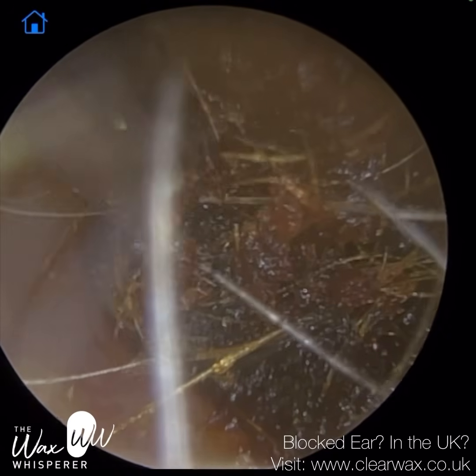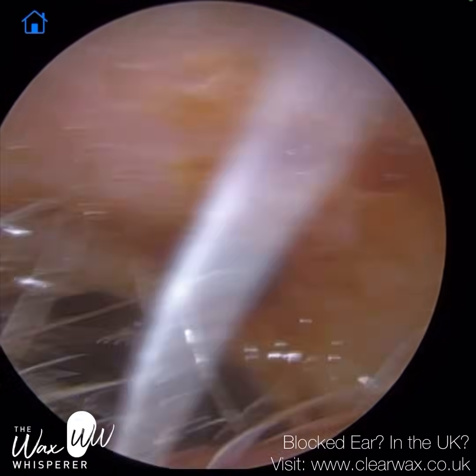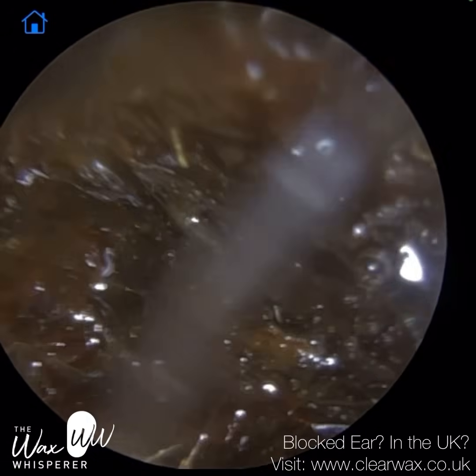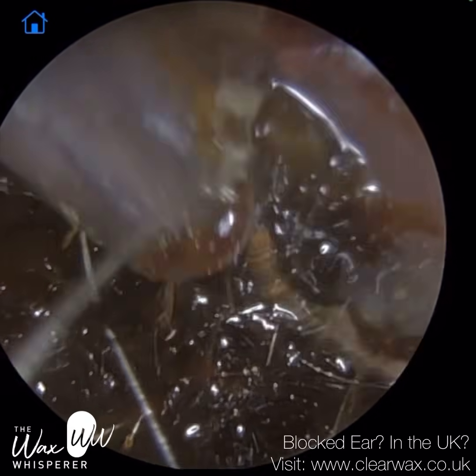So you can see it's quite a lot of hairs, and these hairs do make it a lot more difficult to remove wax because it forms like a matrix, a spider's web, where the wax can attach itself, making it just a bit more difficult to remove.